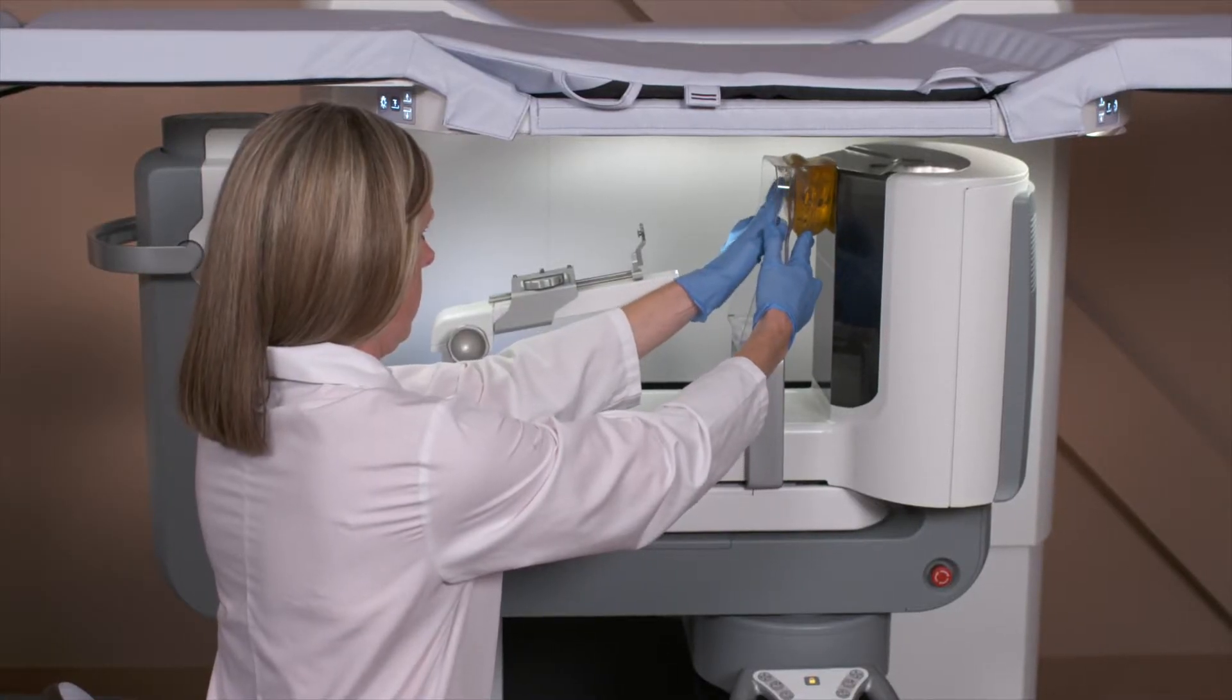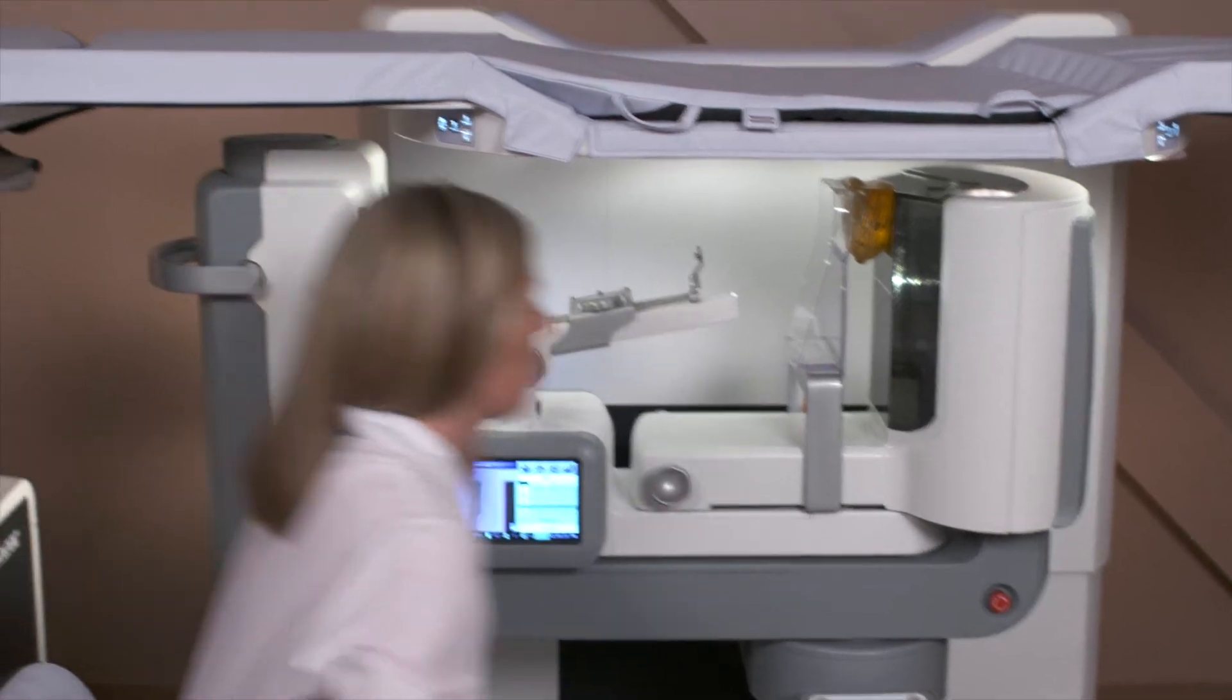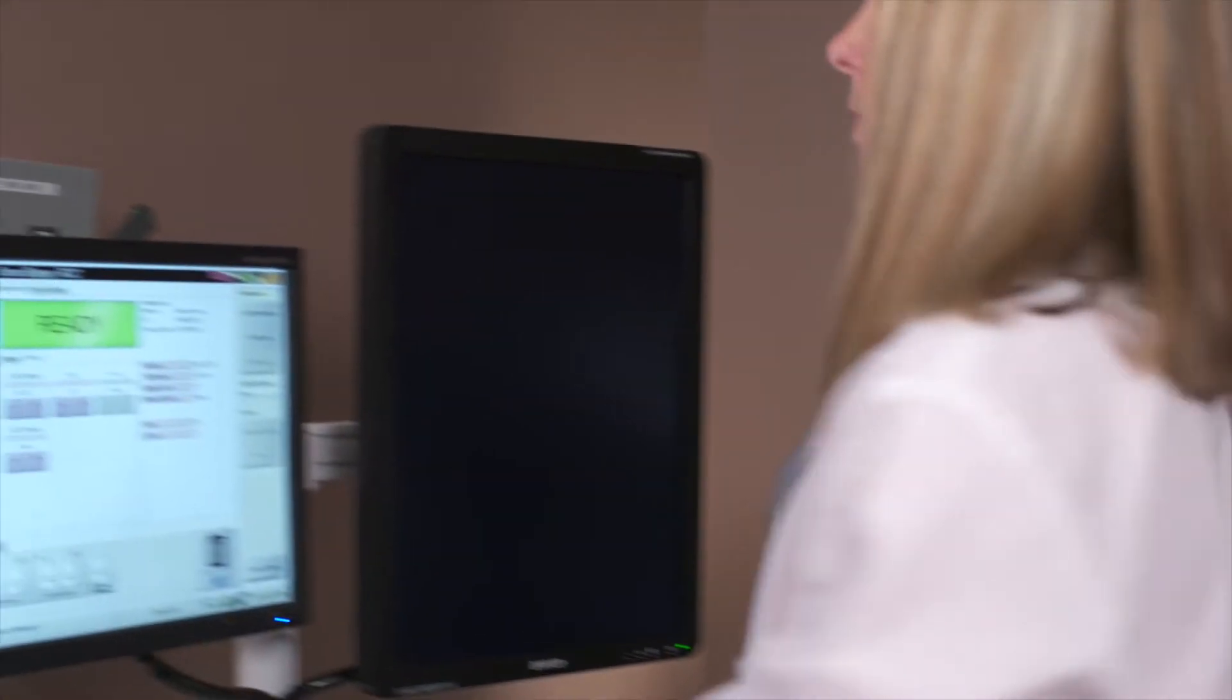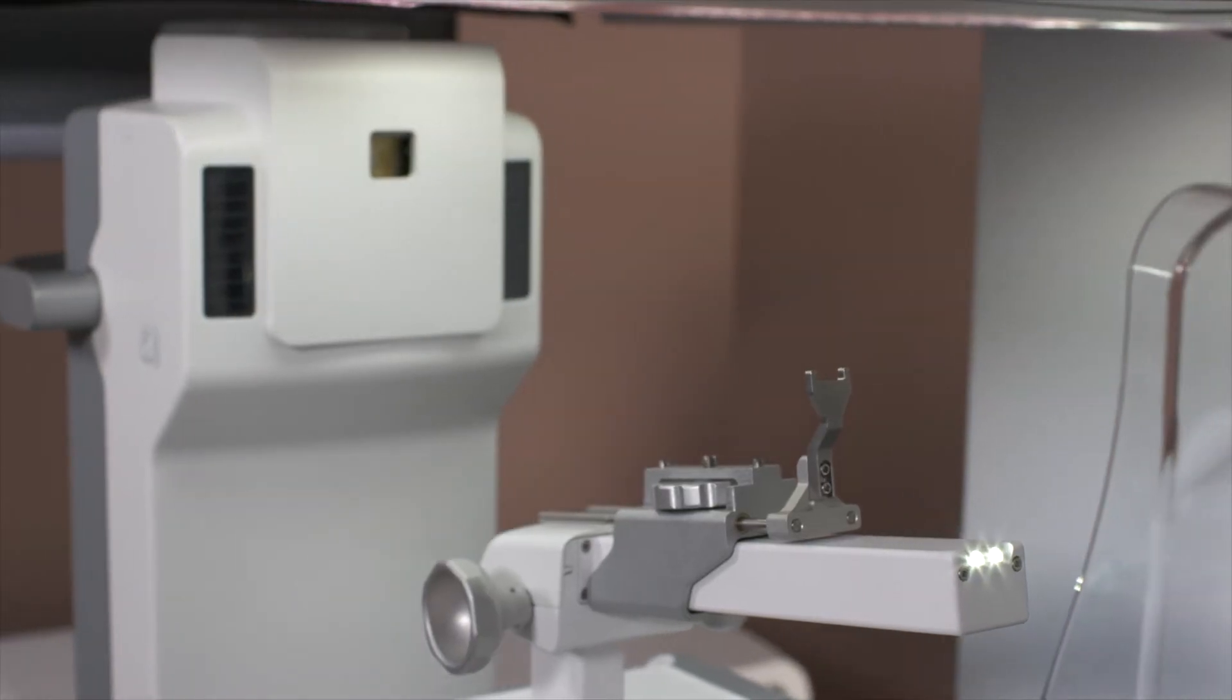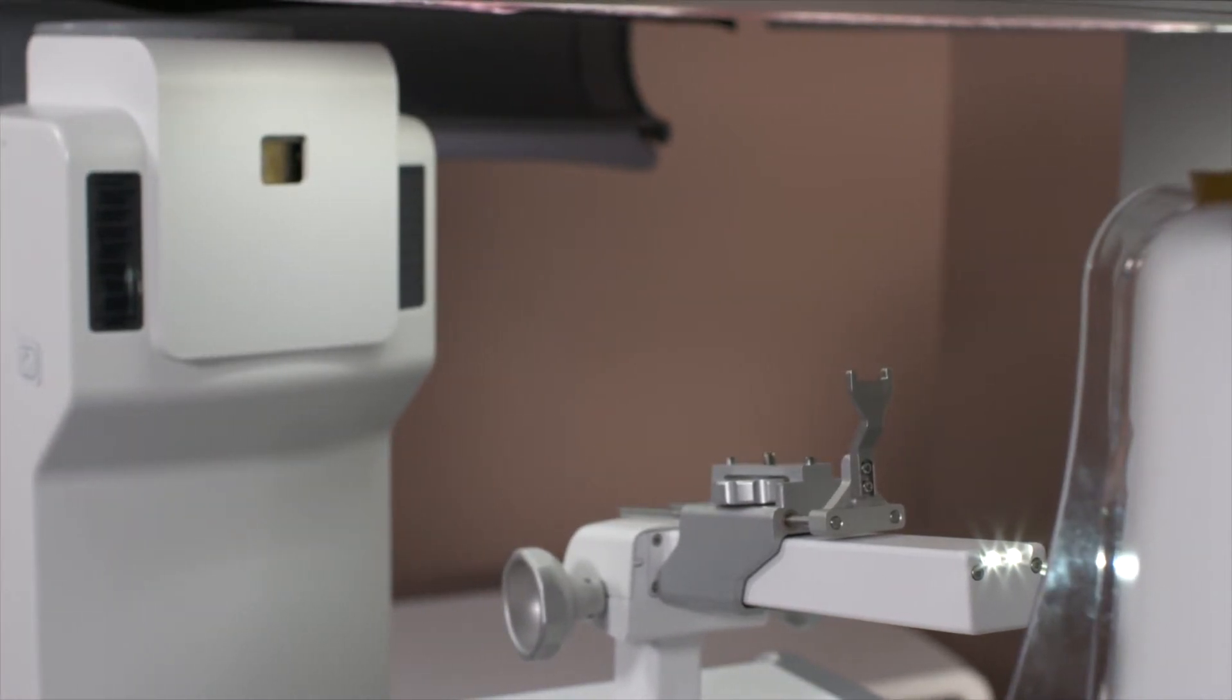The breast is compressed via a foot pedal and compression knob. A scout image is taken and is used to verify that the lesion is accessible.